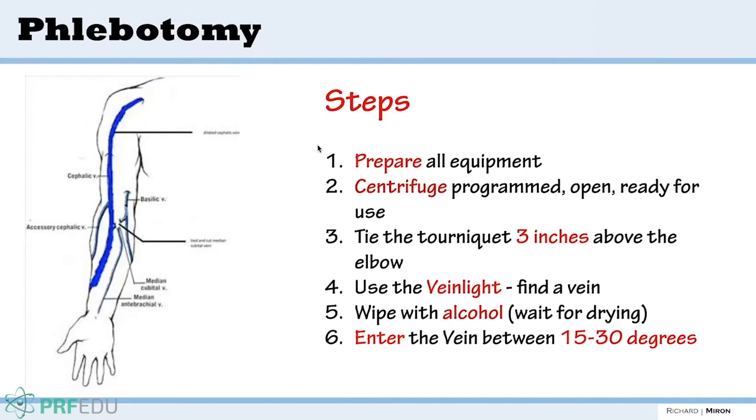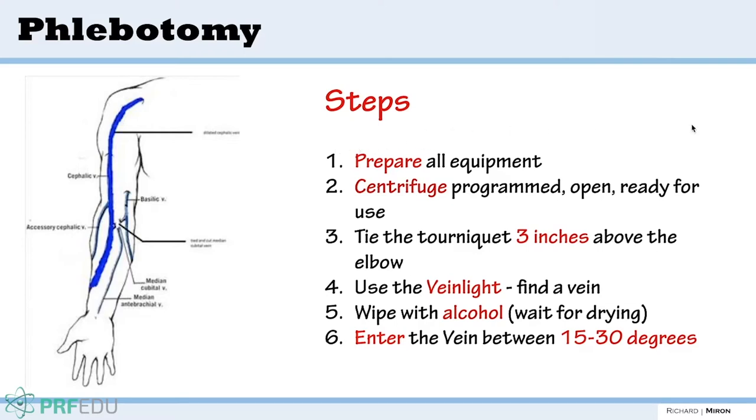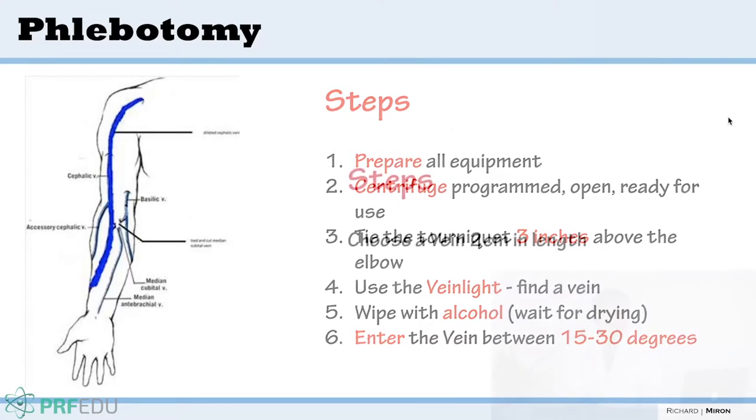Since we're working without anticoagulants, we have to be fast, we have to prepare all the equipment, and the centrifuge has to be set, programmed, open, ready to go. And then typically what we're going to do is take the tourniquet, tie it 3 inches above the elbow, use a vein light, the vein finder, wipe with alcohol, wait for drying, and then enter the vein between 15 and 30 degrees. I'm going to show a video where we go over the entire protocol, which will make it easy for you to follow and see the steps.